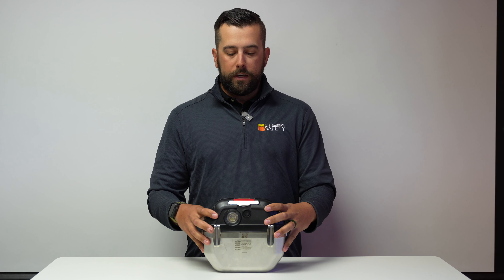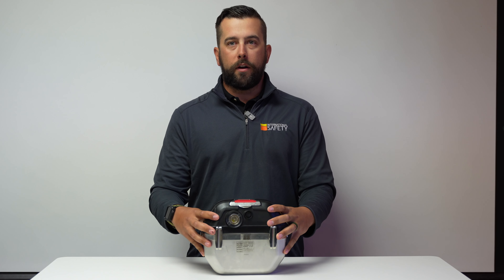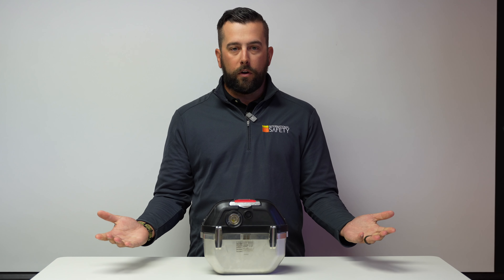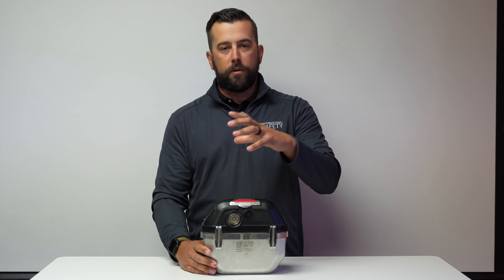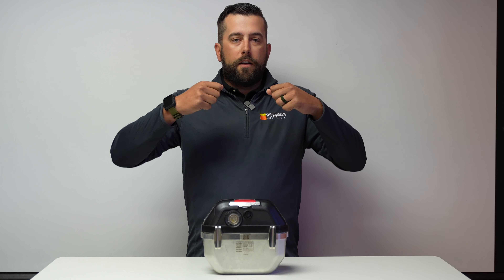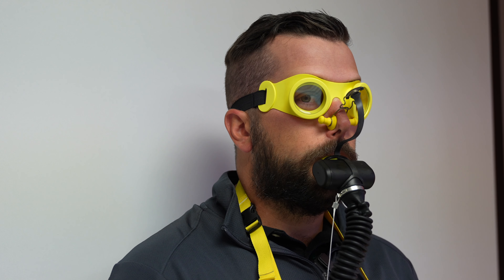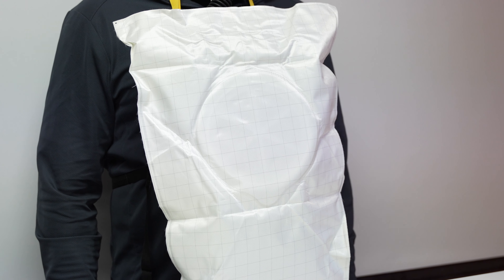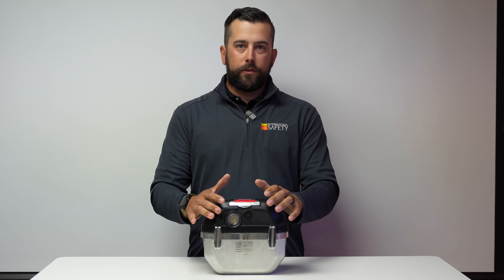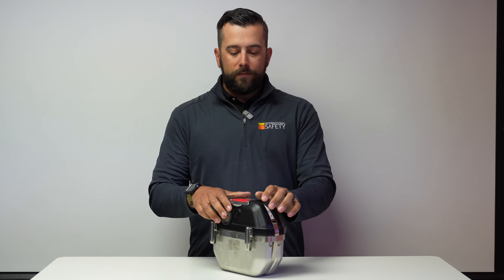Now I'm going to open this unit up and show you how to properly don it. First, I'm going to open up the hasp on the top — that's going to release all these straps — and then I'm going to take the top housing off. Once I'm into the unit, I'll have a yellow strap. I'm going to pull that and have the neck strap to put around my neck. Then I'm going to pull the mouthpiece out, put it in, attach my nose clip, and that will actually activate the Oxy itself. From there I'll put on the goggles, tighten up all my straps, and I'll be safe and ready to exit.